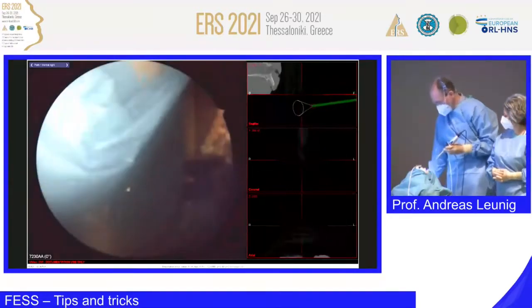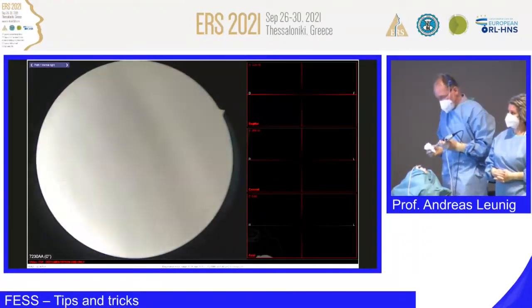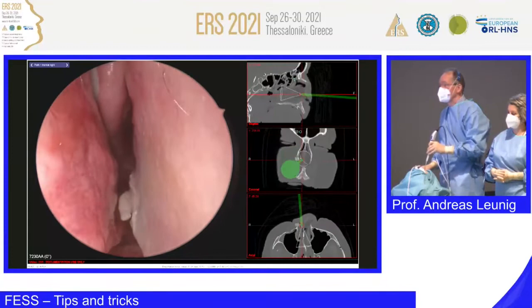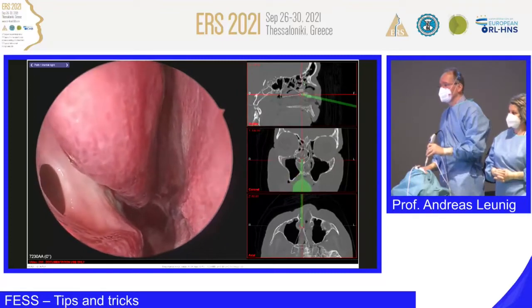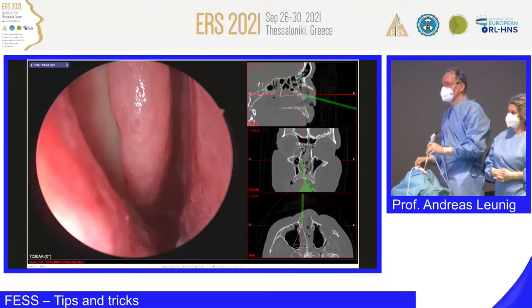Okay, it's a so-called accessory ostium. It's a perforation in the periost of the medial maxillary sinus wall. And it depends on the case if you have to deal with this, if you have to combine with the natural ostium. So we will see later on.